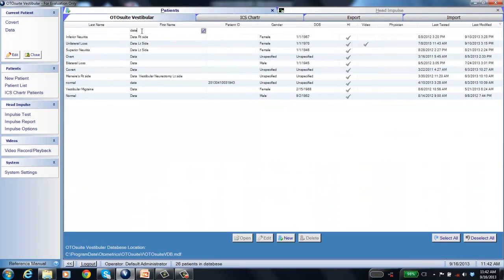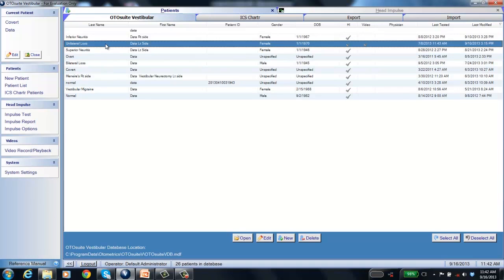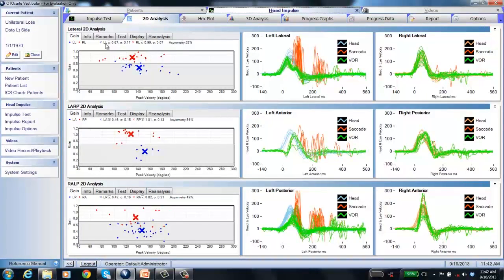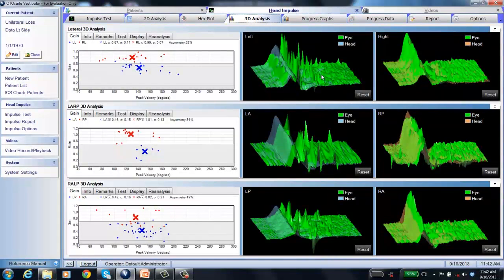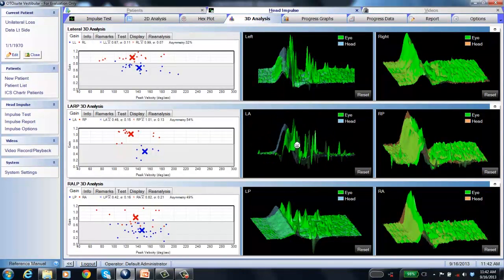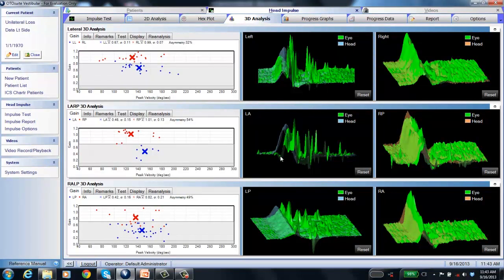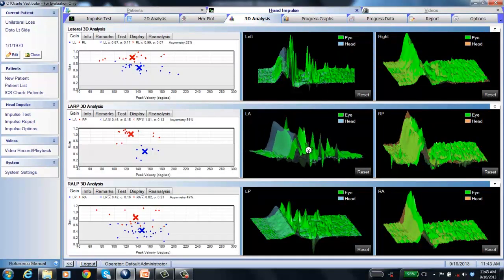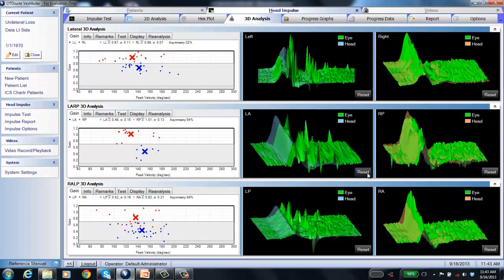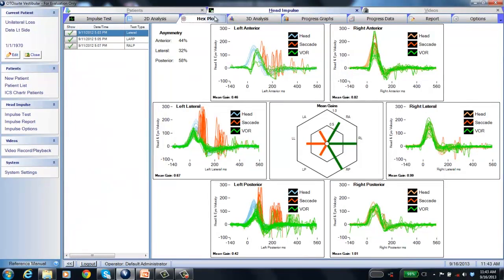Looking at a unilateral loss: the left side is abnormal, the right side is normal. The red gain points are in the white region; the blue gain points are in the gray region, with clear red spikes. In 3D, Michael Hamagi's 'canyon' effect is visible — a large gap between the head movement (blue) and eye movement (green), especially in the left anterior. Where you see that canyon, the gain is not working appropriately. In the hex plot, the left side is orange (abnormal) and the right side is green (normal).